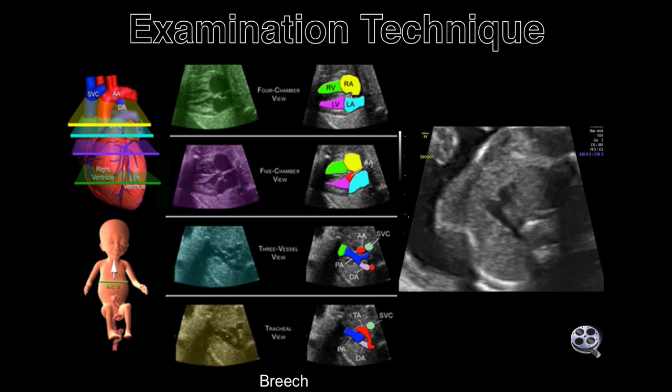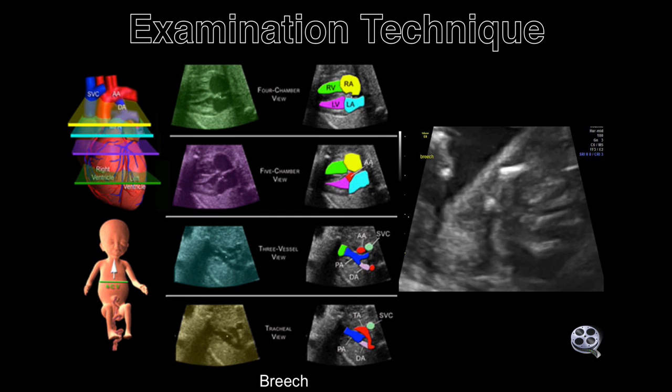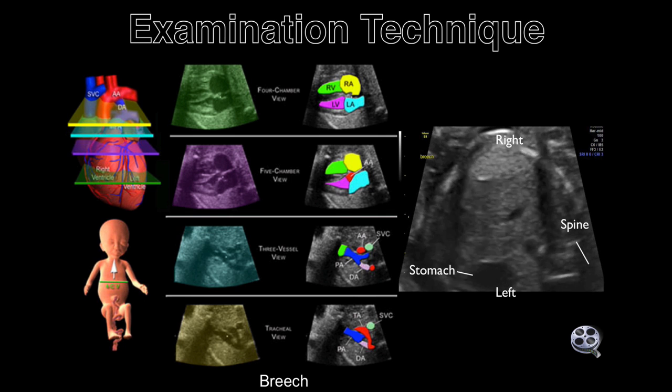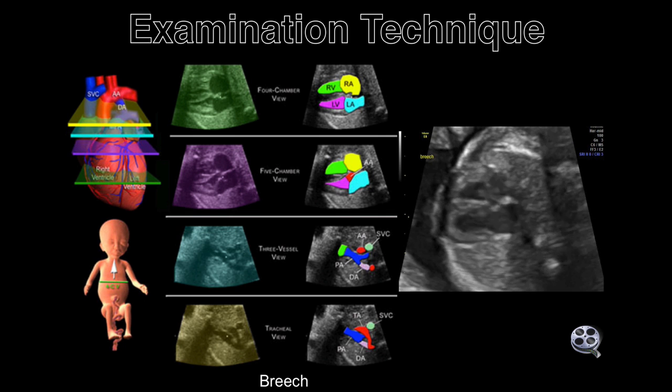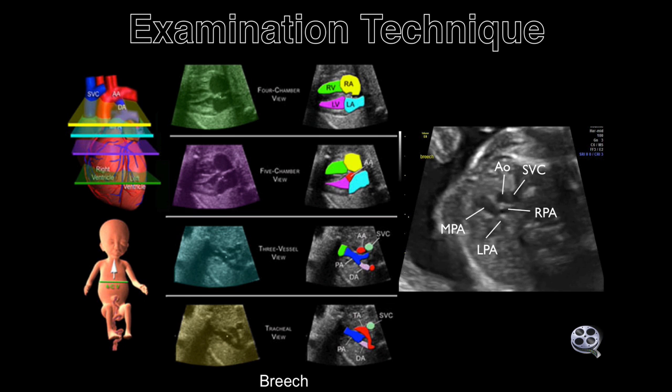2. The five-chamber view. This contains the left outflow track as it exits the left ventricle. The first portion of the ascending aorta is identified in this view.